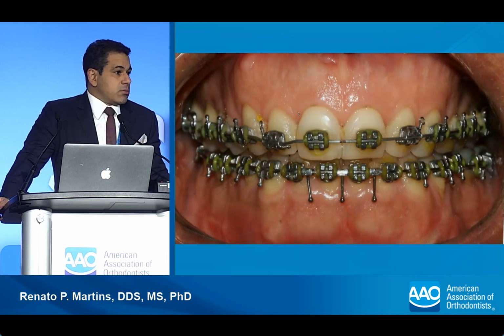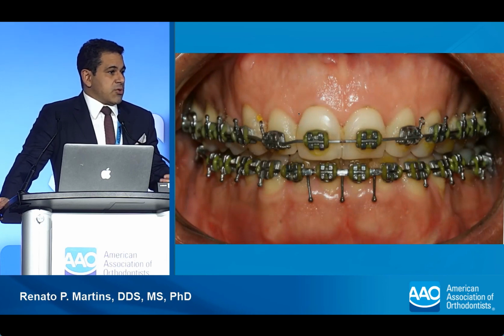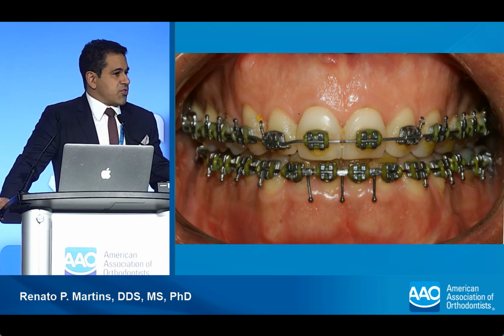This is what happened to her post-surgically. She got a rotation of maxilla and mandible counterclockwise. And she came back to the office and she wanted to finish treatment with aligners, and she could not open her mouth. I could not fit the scanner. So I told her, well, once you can open your mouth, we can go back to aligners. And it took her 3 months to be able to open her mouth so I could scan it.